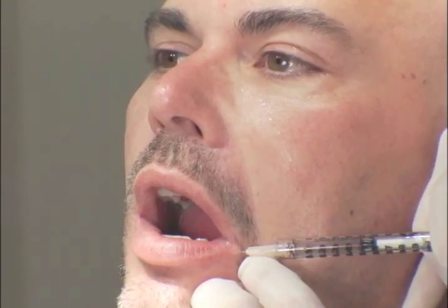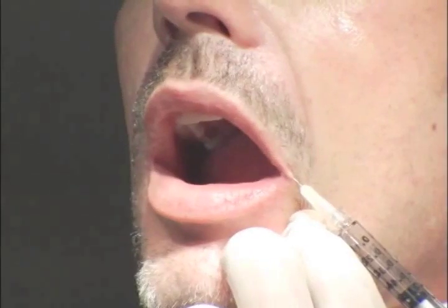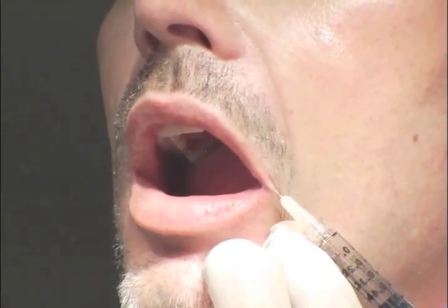Okay, now I'm going to move the needle as we went in, and now we're going to lift up the corners of his mouth. To lift up the corners of the mouth, open up your mouth just a bit, we use our trick injection inside the mouth, because we lift up the corner from inside the mouth. We go into the potential space on the mucosal side. And we move the needle very easily. Now close your mouth. As you can see, his mouth goes horizontally now.